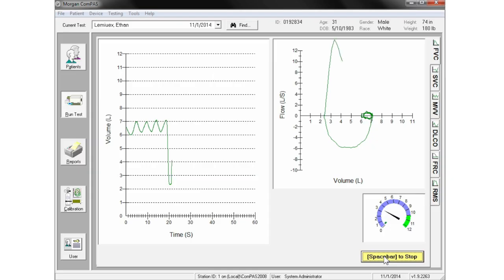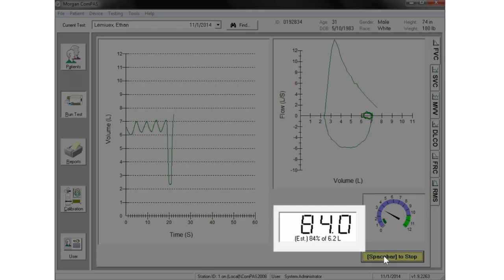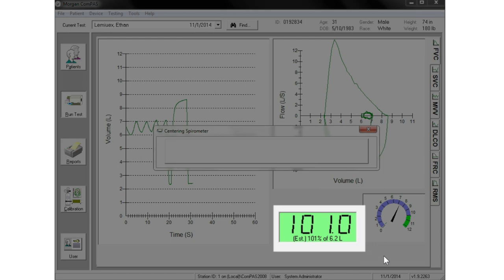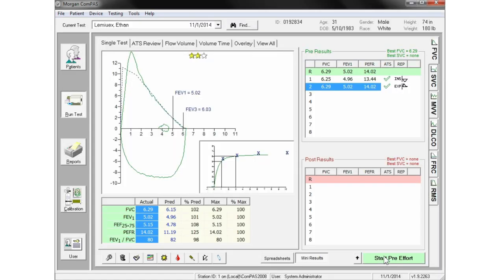On subsequent efforts, a percent of best FVC meter is also displayed. When this climbs beyond 95% and the FET meter is past six seconds, most efforts will meet ATS acceptability.